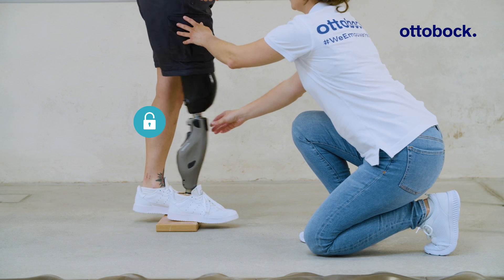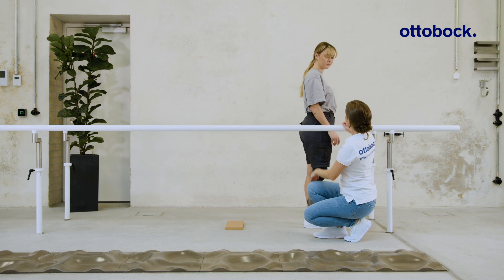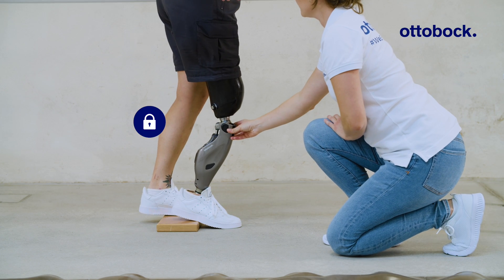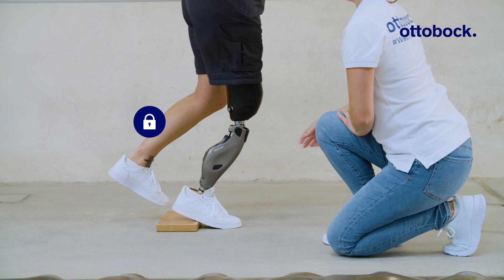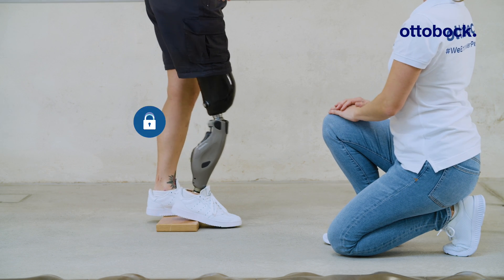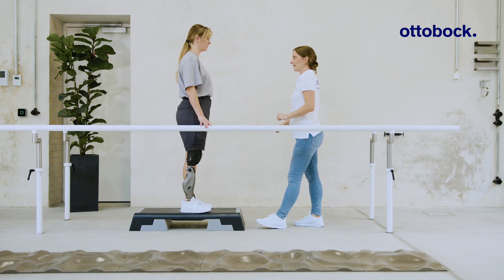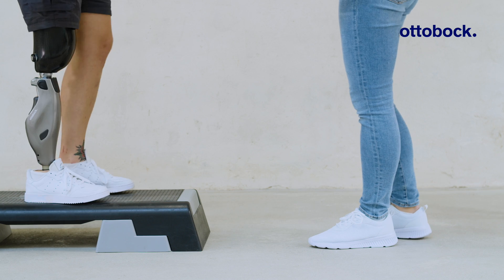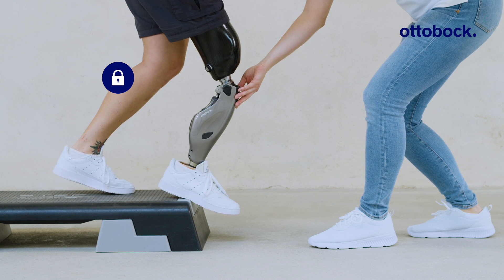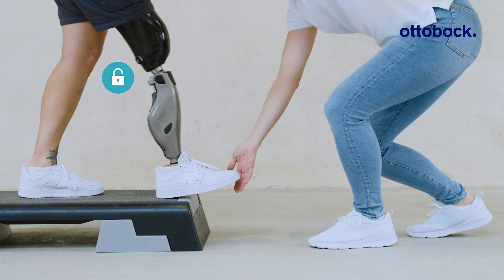For deactivation, the user must extend the knee joint, or unload the prosthesis and take a new step forward. Please remember that taking a step down a stair out of the deliberate setting, or taking a yielding step, is not possible. Therefore, always unload or fully extend the prosthetic knee joint with this setting.